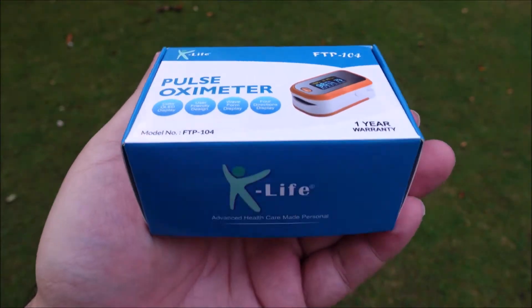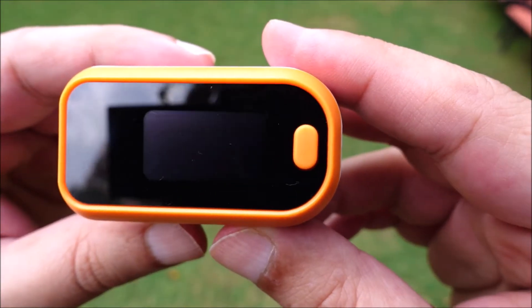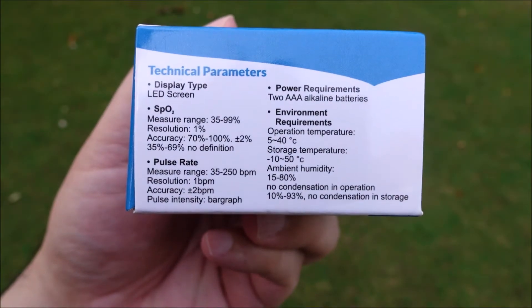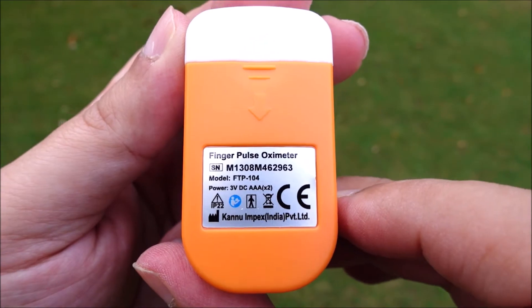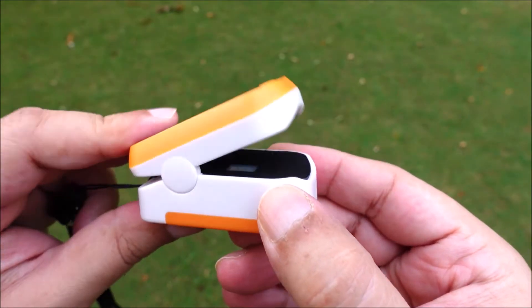K-Life is a trusted brand for medical equipment. The oximeter has a decent build quality. It comes with a one year warranty. It has an LED screen display, requires two AAA batteries to operate, and has a clipper design.